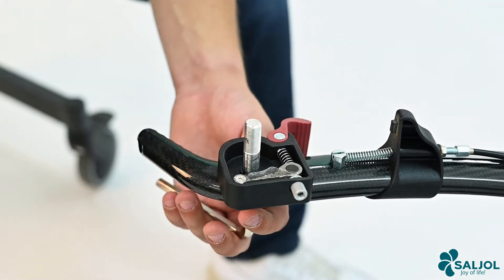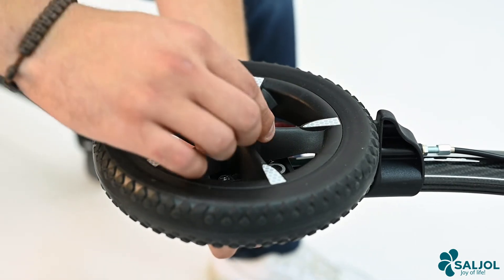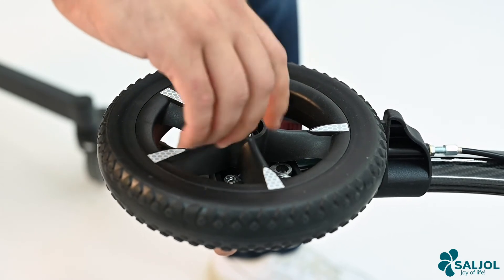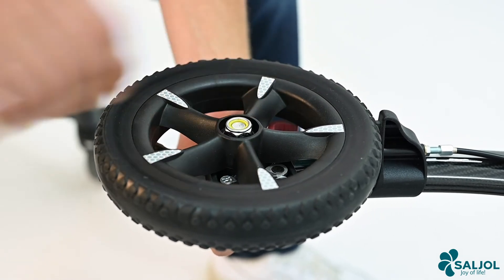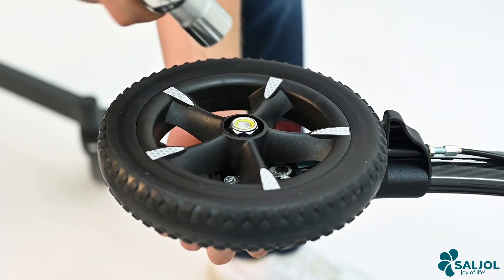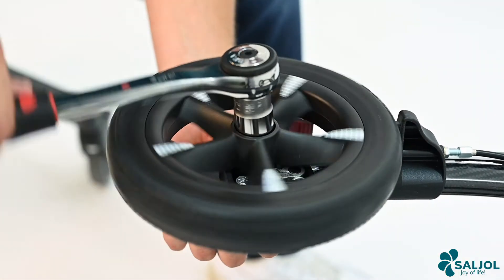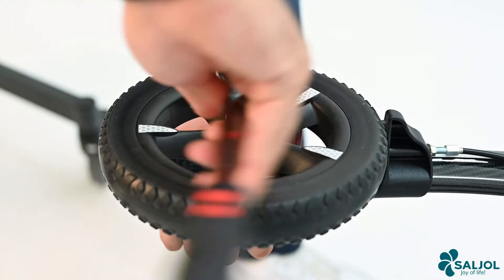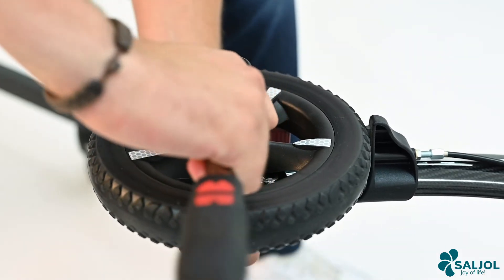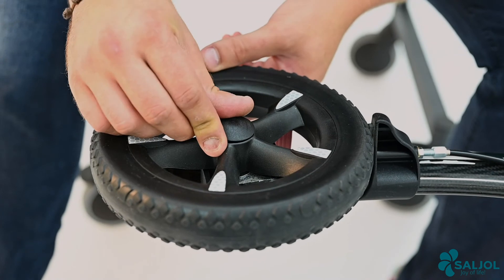Put the wheel back on and retighten the nut by hand. Take the allen key and the ratchet and tighten the nut completely. Then put the wheel cap back in place.